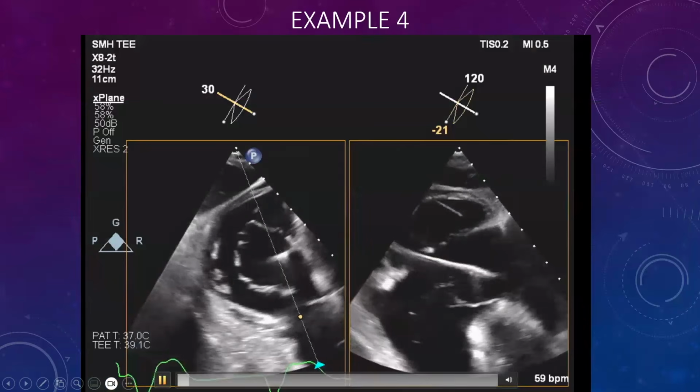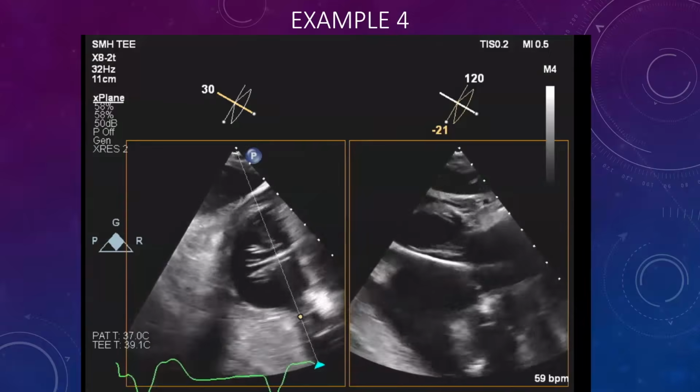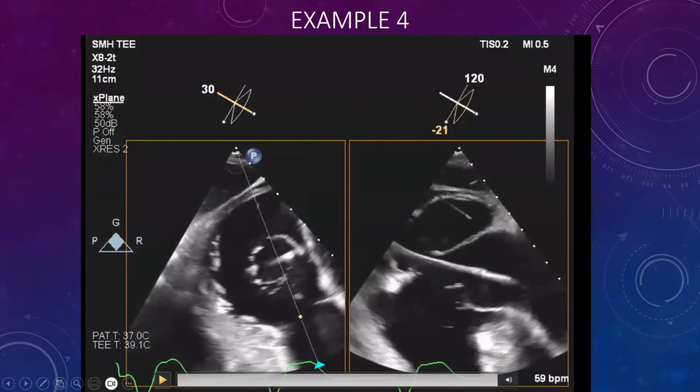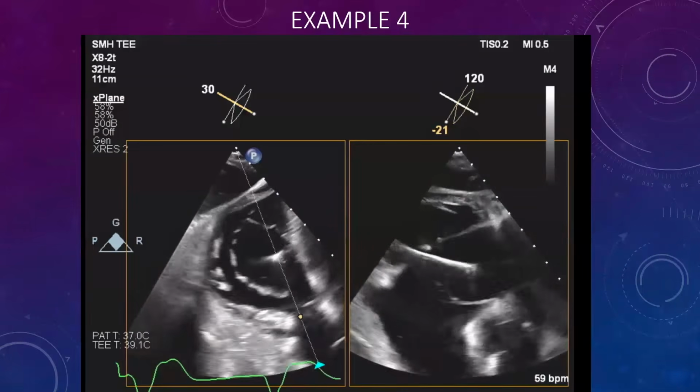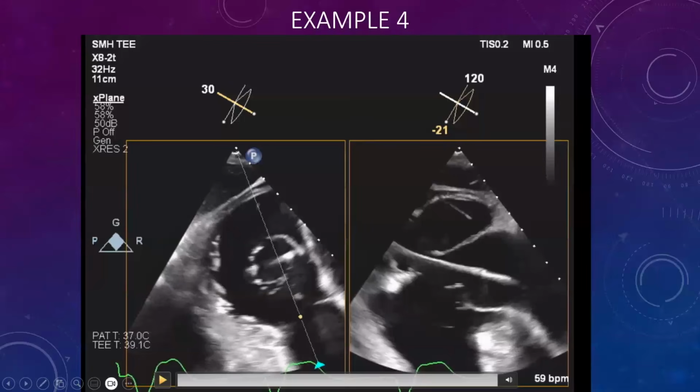Okay, and then here again, we have another pacemaker lead example where you have a pacemaker lead going through. Is the pacemaker lead a bystander? Is it involved? Involved or bystander? Can you play it again? Yes.